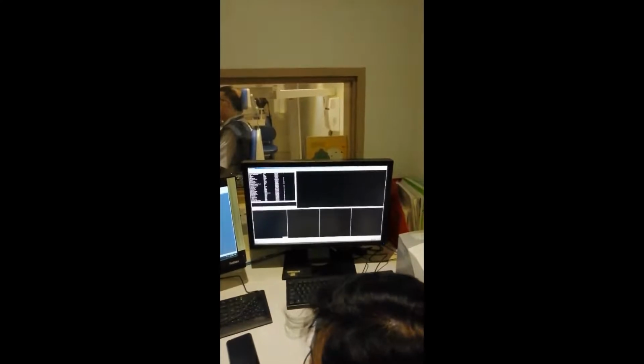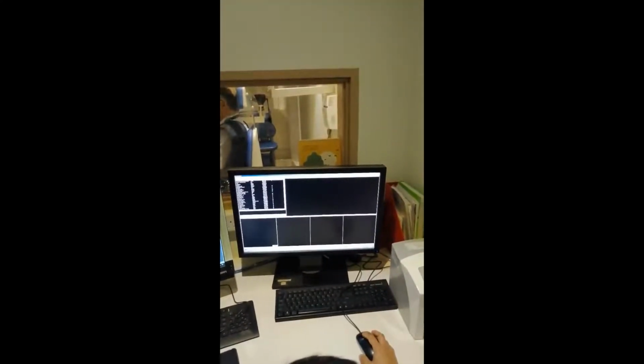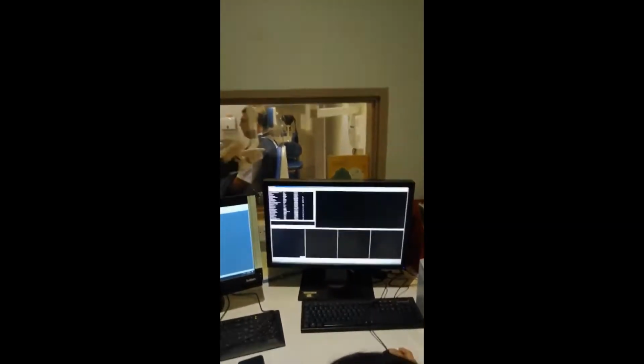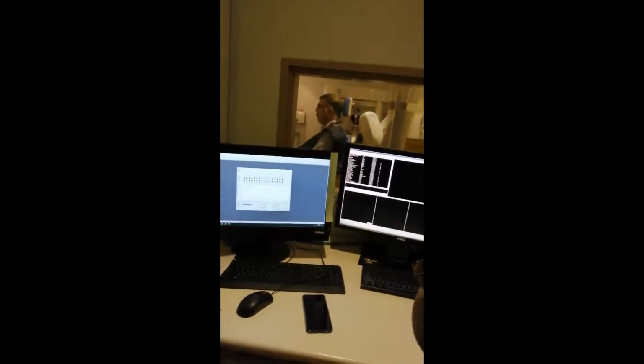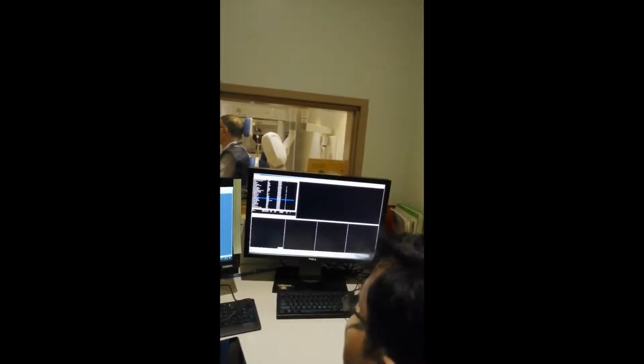Okay. Let us see. Let us. She's not getting ready. Holding it right. Bisecting I think it can't be placed. That's why she was holding. Usually she won't. She will come here and expose. Okay, let me check. Yeah.